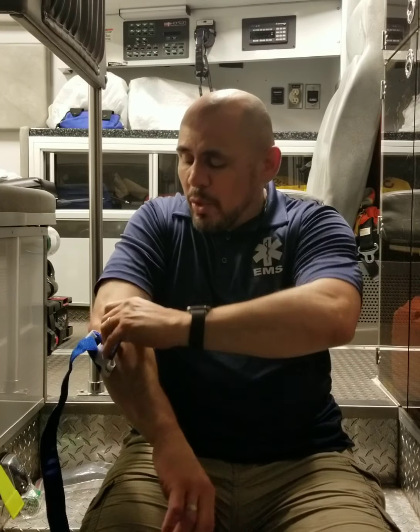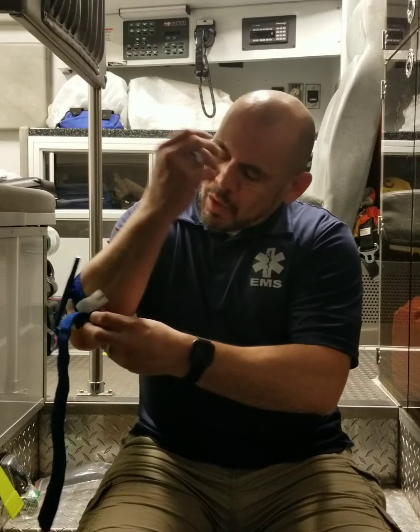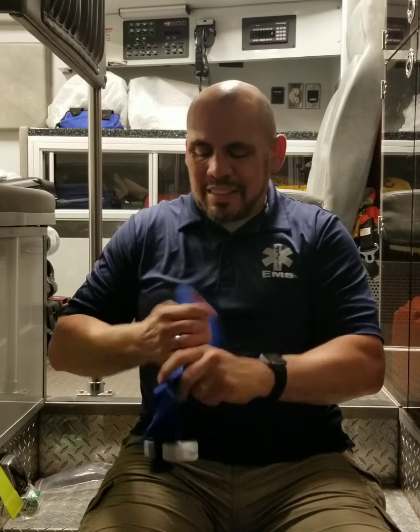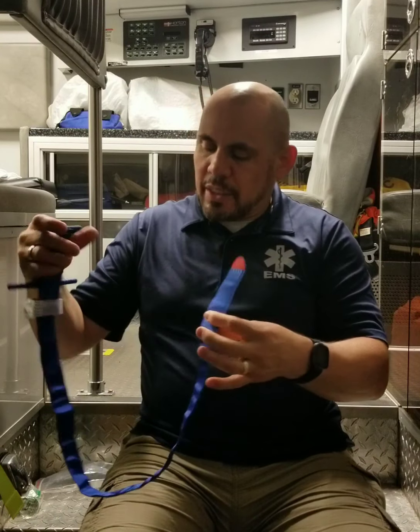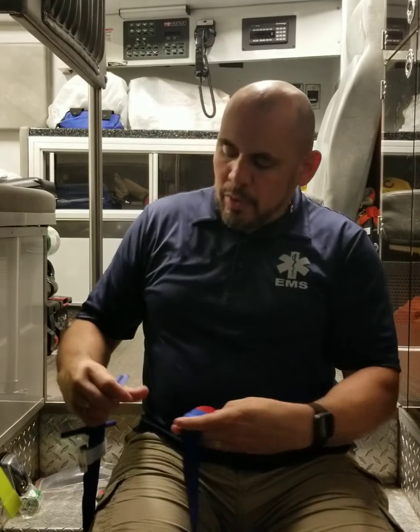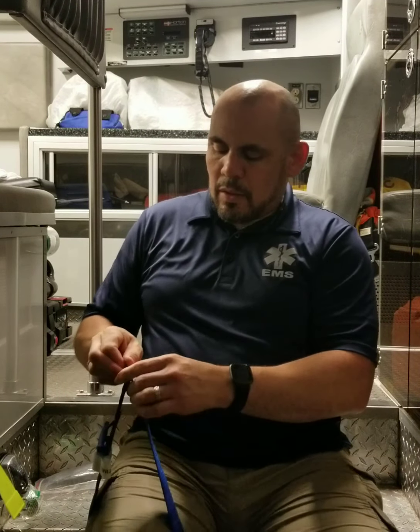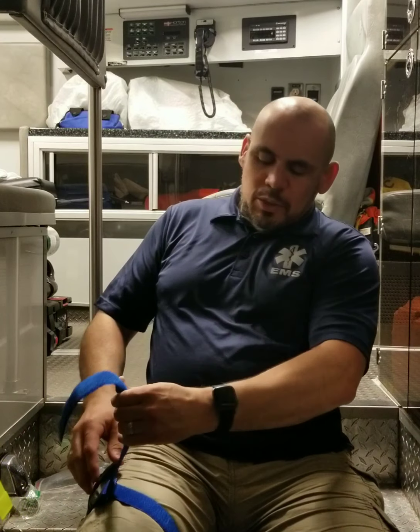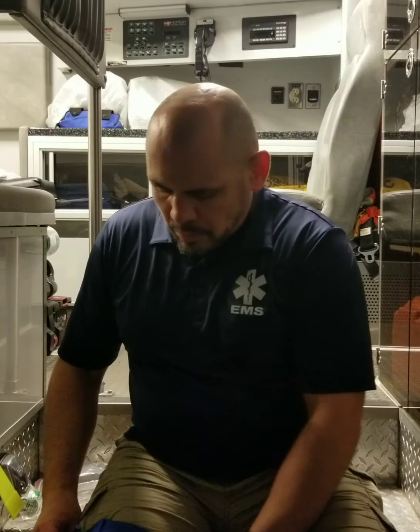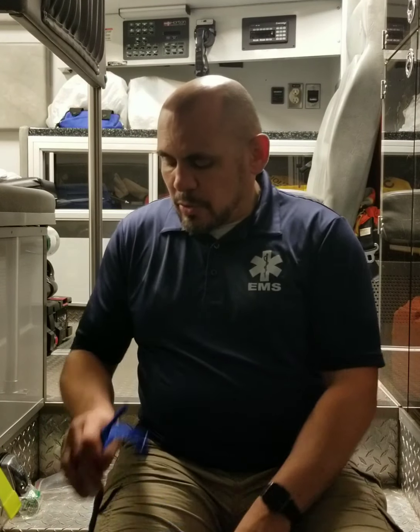When you don't feel a pulse, obviously you're going to feel your hand going numb. You know it stopped, but you really want to turn it. This will hurt. Same thing on the leg. Again, this does come out. Again, it's not a lesson on how to put a tourniquet together, but it's just a belt. Treat this like a belt. This is like putting a belt on. Feed it through. Sink it in here again. Pull it as hard as you can. You really want to pull as hard as you can. Velcro it, go all the way around. You want to tighten it. Again, bleeding stops. There's no distal pulse. All right. So those are variations.